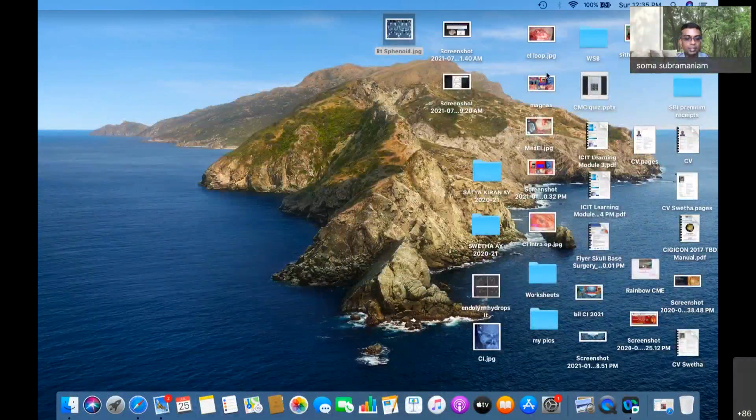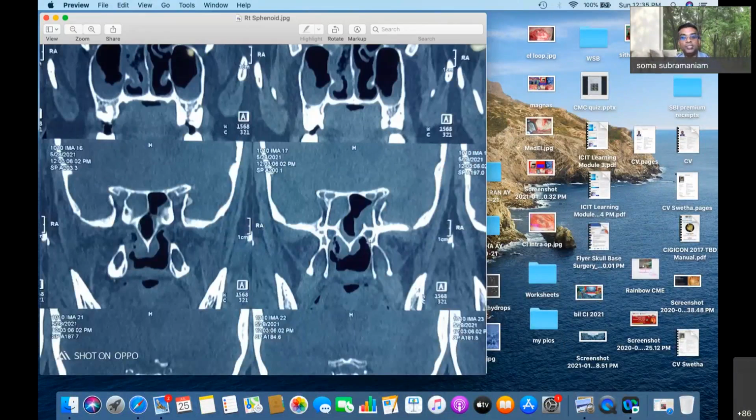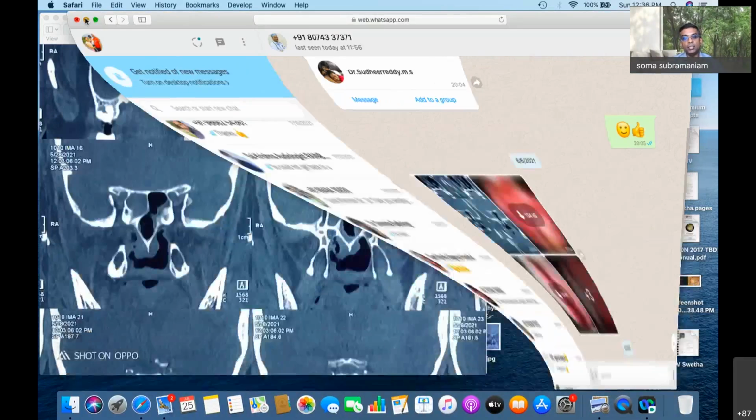One, I would say that the smaller your pituitary or the less pneumatized the sphenoid sinus, all the more the wider the approach should be, because that is where you're going to run into complications during surgery. You're not going to get into complications with a widely pneumatized and a very large expanded sella. You're going to run into problems where it is contracted. So always get a wide approach. And by that, I mean using bilateral rescue flaps, removing the rostrum, creating a wide access so that the surgeons can work without any hindrance. And spend some time doing that so that your eventual surgery becomes a lot easier, especially in non-pneumatized sphenoids where the carotid cannot be seen.